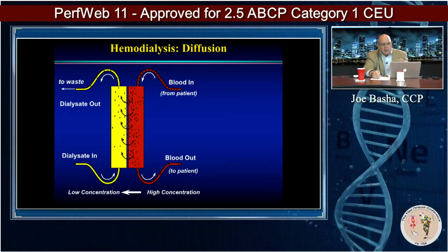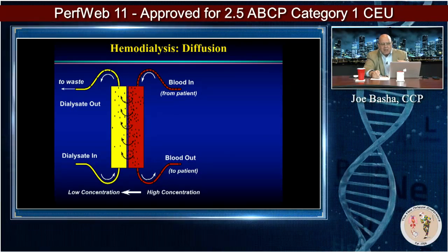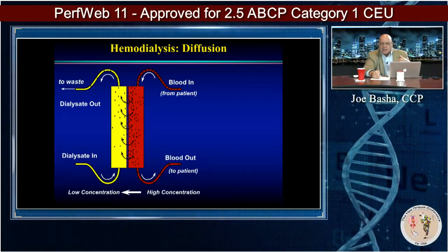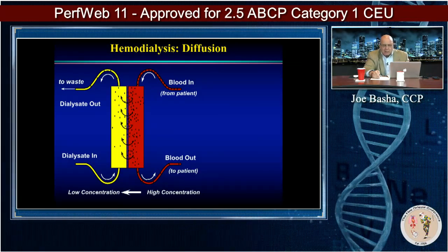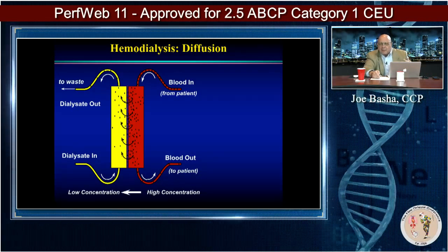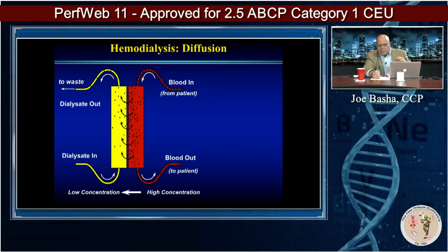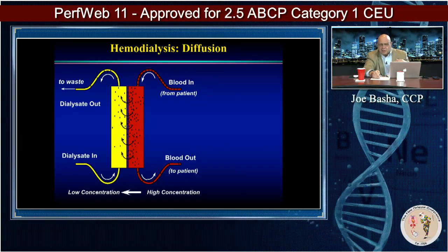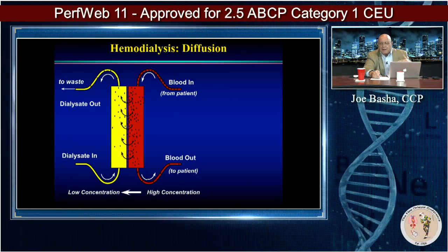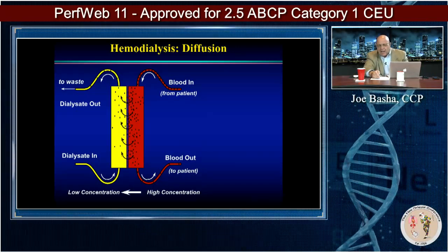But I am going to say that when you do continuous dialysis with a CRRT machine, you will have both diffusive clearance and some level of adsorption. So some of the inflammatory mediators that are too big to cross over will stick to the fiber bundle and eventually clog it up if it's high enough. So it's one of the things that you can do when you have a patient who is in fulminating SIRS. You can put them on a device. You'll frequently have to make changes to the filter if they have a very, very high inflammatory mediator load. And of course, you're going to do some ultrafiltration with it so you can remove volume as well.